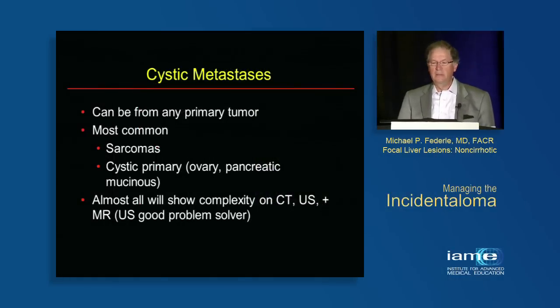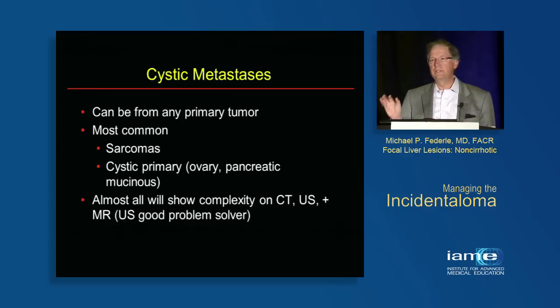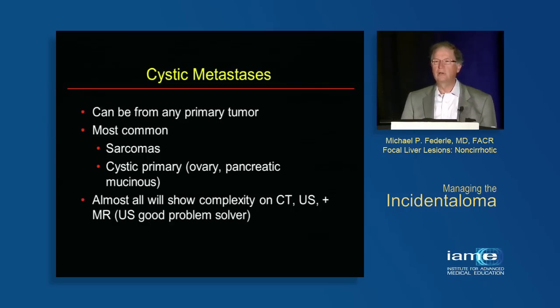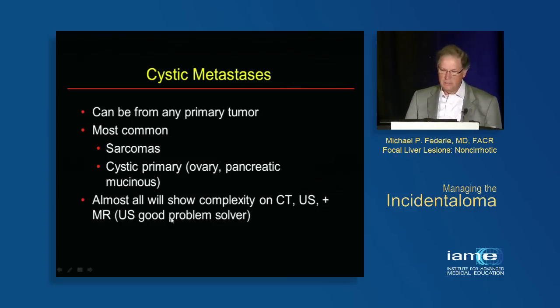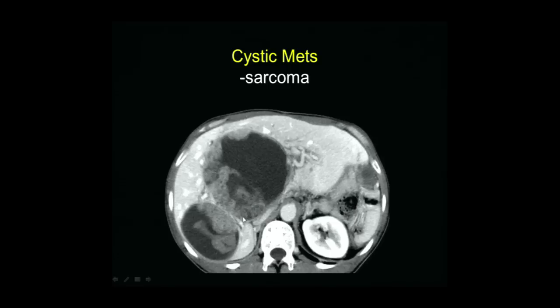Let's talk about cystic metastases. They can occur from any primary tumor, but two to think about in particular: either the primary tumor is cystic like an ovarian cystadenocarcinoma, or the family of sarcomas — particularly GI stromal tumors. Metastases from those entities account for the great majority of cystic metastases. Almost all will show complexity on CT, ultrasound, and MR. On T1 and T2 here there's fluid in a large cystic space, but there is enhancing mural nodularity, a very thick wall, and settling of debris — proven metastasis from a primary sarcoma.